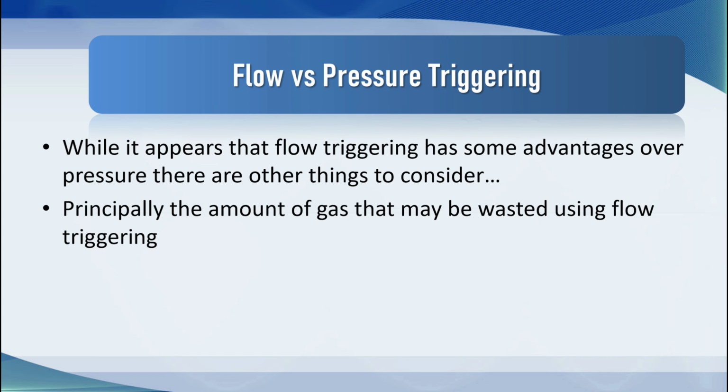Not that far in the past, we had a global pandemic where hospitals may have had several hundred patients on mechanical ventilators simultaneously, and the oxygen supply to that hospital was precarious. The last thing that we needed in those situations was to be venting out gas into the atmosphere unnecessarily because of dialing up at fairly high levels of flow-by.